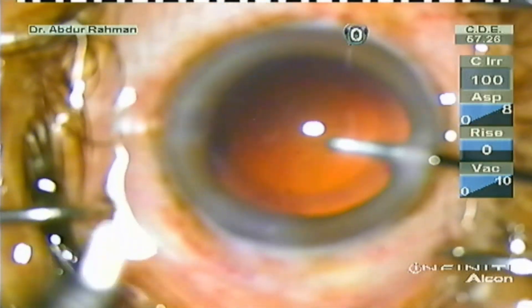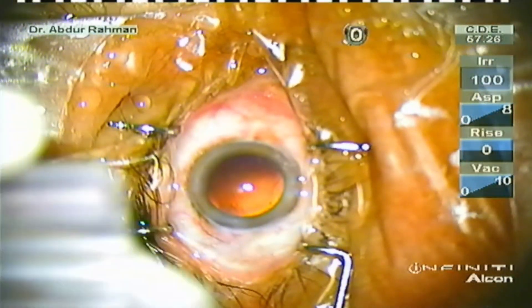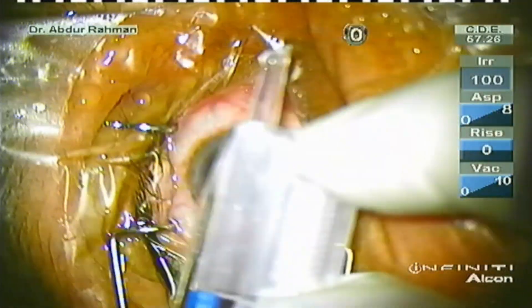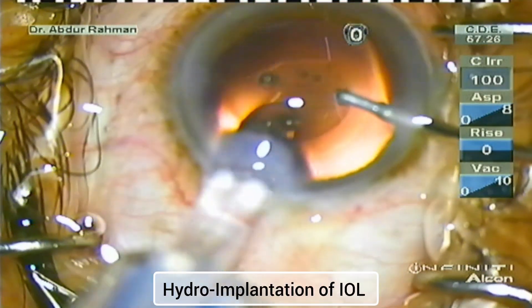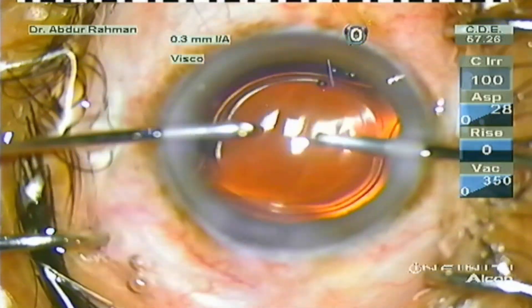Now perform hydro-enlargement of the main port — I have enlarged the main port to 2.8 mm. Now commence with the IOL loading in the cartridge. Put the magnification at the lowest setting so you can see easily how the lens is being loaded into the cartridge. I'm going to perform hydro implantation of the IOL where the irrigation I/A handpiece is forming the anterior chamber. I have dialed the trailing haptic with the irrigation I/A handpiece also.